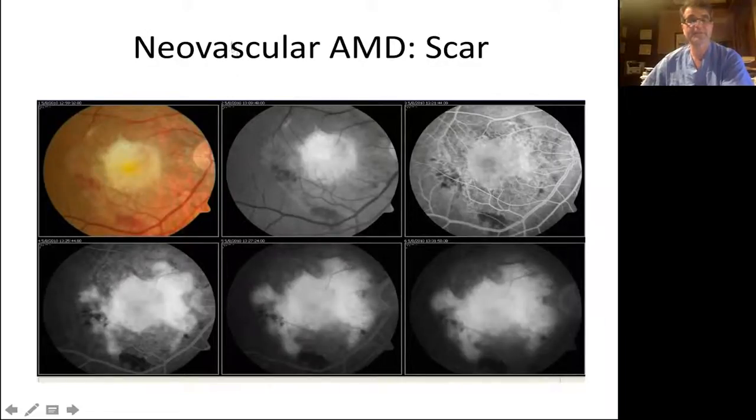It looks like I have some questions. Okay, two questions. Number one, regarding macular puckers, do you find baseline OCT can be predictive of how well the patient will do following surgical repair? That's a very good question.